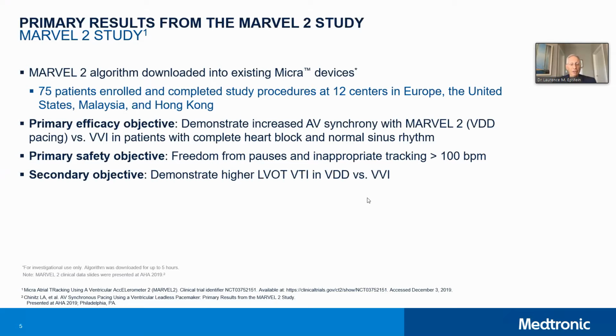The secondary objective was to see whether there was hemodynamic benefit of VDD pacing versus VVI pacing, which kind of makes sense. If you have AV synchrony, you should have better hemodynamics looking at LVOT VTI. Next.